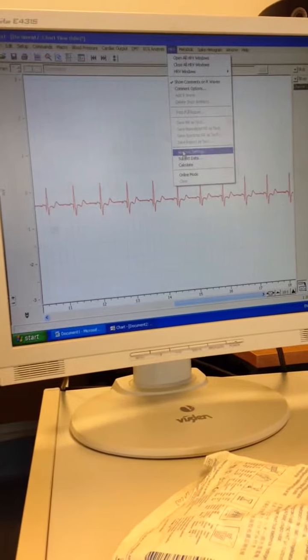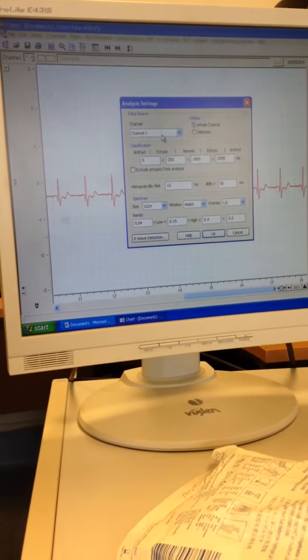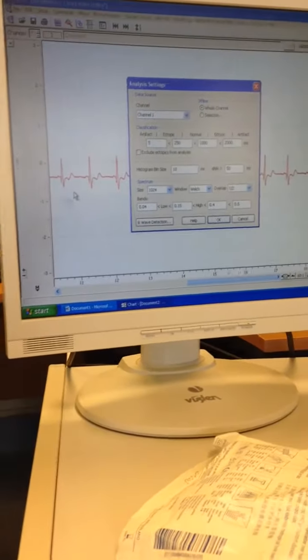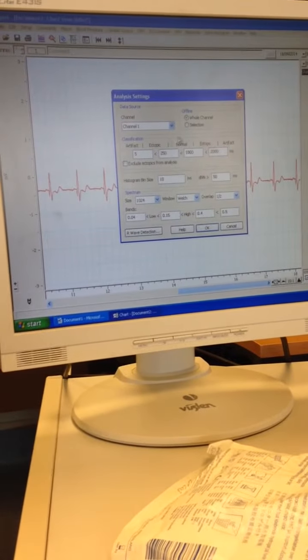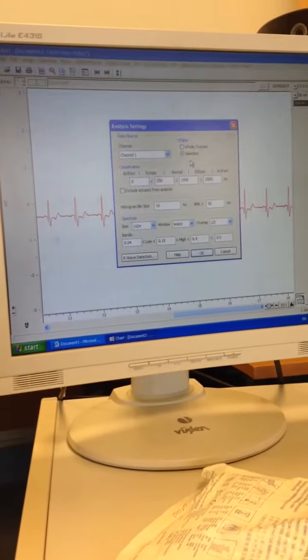5 minutes of your interview, say, go analyze. This is your channel 1 because it's channel 1. Now, you can analyze the whole data, from start to finish, or you can do a selection of just your 5 minutes. So you just click selection to select whatever your 5 minutes is.